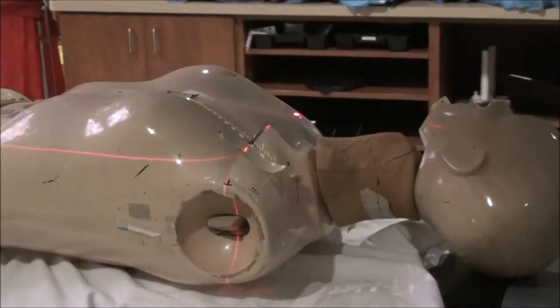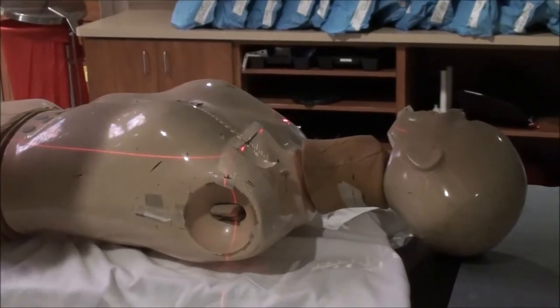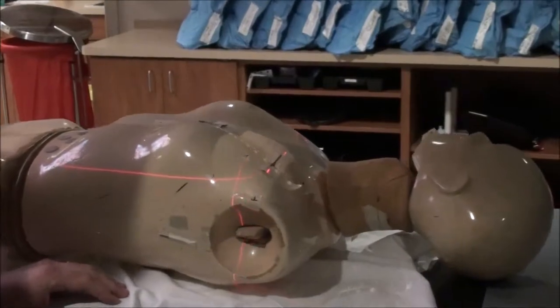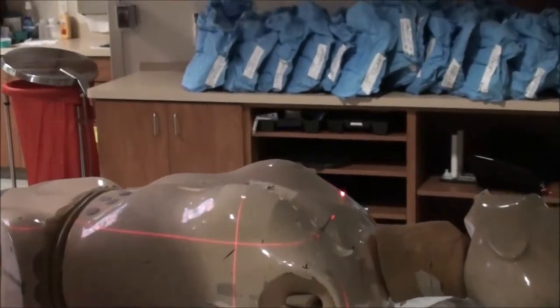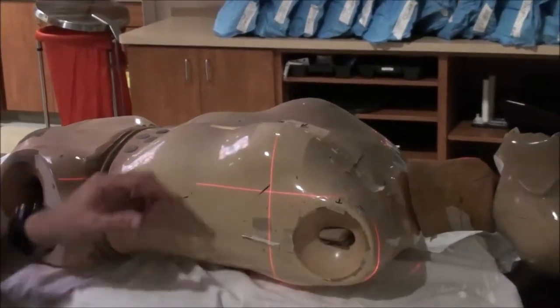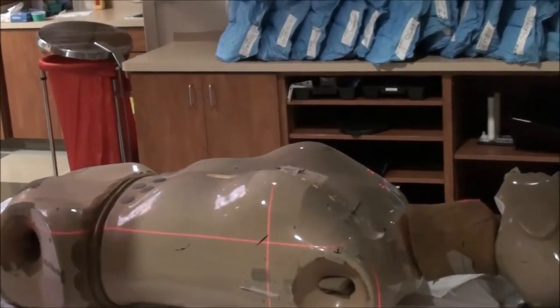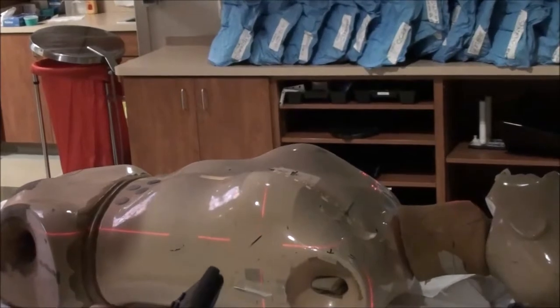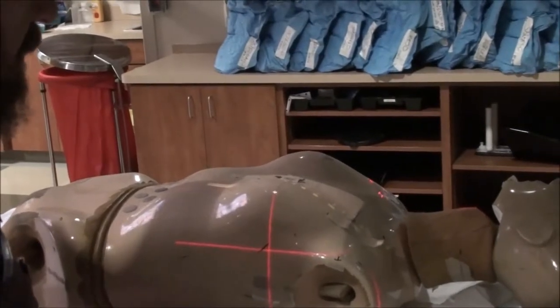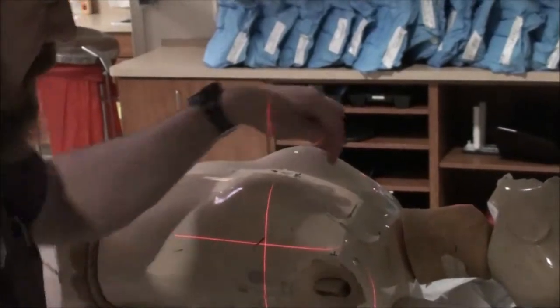All of your breast simulation that we talked about earlier for a regular non-monoisocentric breast is going to be in play. You're still going to ballpark them the same. You're still going to use your lasers halfway between the mid-axillary line and the anterior flash, halfway between the medial aspect of the breast and the lateral flash. You're going to open up your field size to give yourself a little flash inferior to the inferior aspect of the breast and go to this wire.